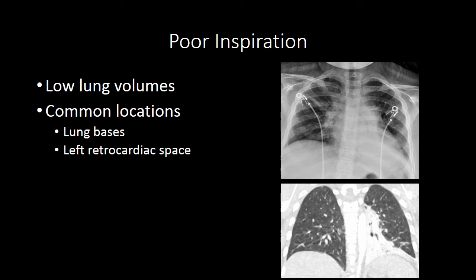Poor inspiration is a common reason for atelectasis. It can be due to debilitation, recent surgery, or recent anesthesia or altered consciousness. When we have poor inspiration, we commonly see atelectasis forming at the lung bases. In this patient, we have a large area of left retrocardiac atelectasis — you can even see a little bronchi highlighted there. This is the CT from the same patient, showing near-complete collapse of the left lower lobe.